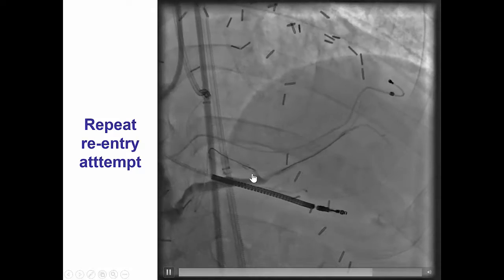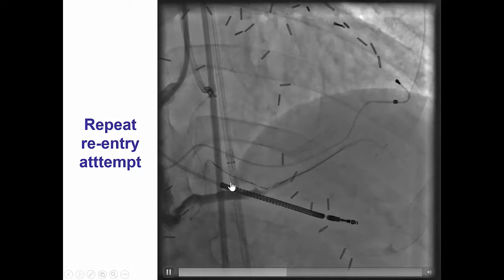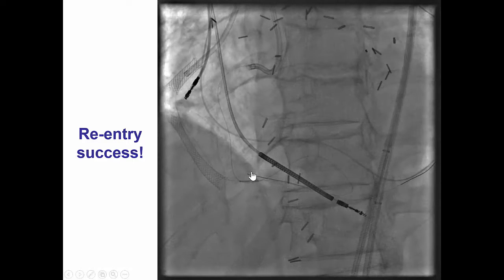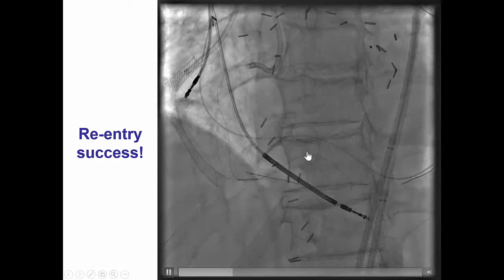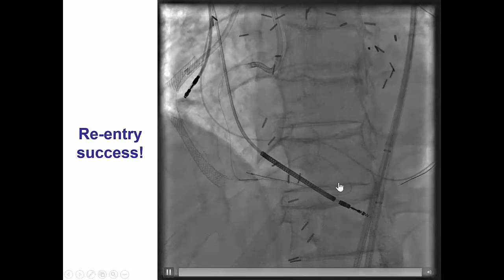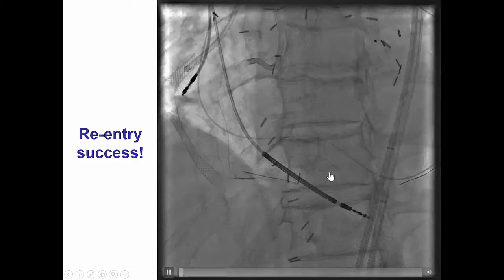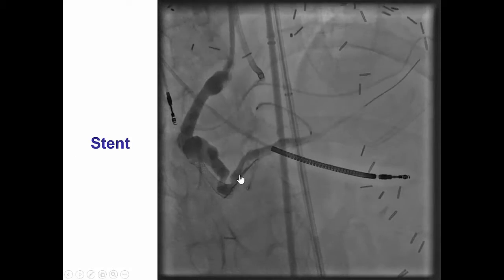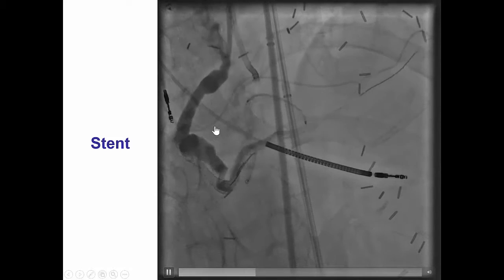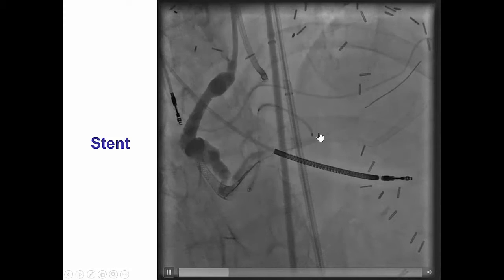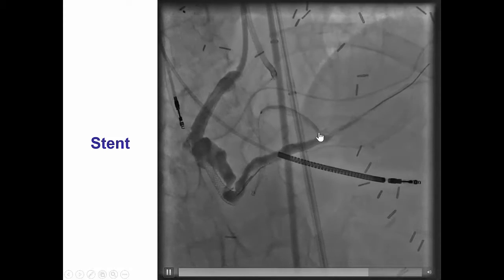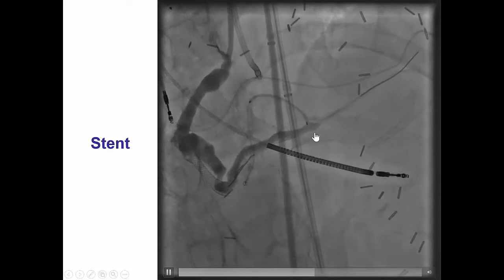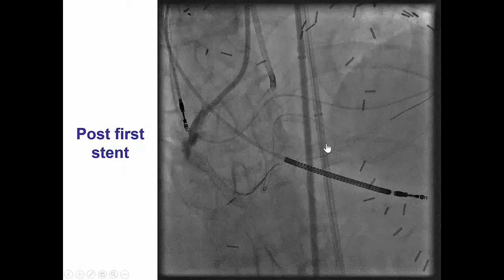We performed repeat re-entry attempts with the Stingray system using the stick and swap technique, trying to advance the balloon on the side port. After multiple attempts, we were finally able to re-enter into the true lumen and advance the wire retrograde through the saphenous vein graft. That was very useful because delivering a stent across the large tortuosity was very challenging, but we were eventually able to deliver a stent all the way into the distal right coronary artery, abutting the area of the saphenous vein graft touchdown.